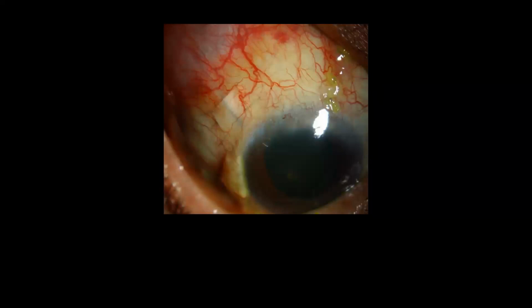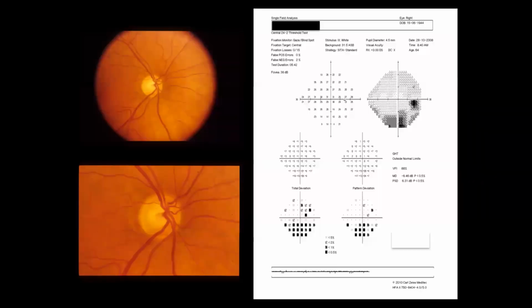So not having a patch graft is no excuse not to operate on the patient. You can create a scleral flap and insert the tube under it, like what you do in trabeculectomy, but make sure that the sclera is of good thickness so that there will be no erosion or complications.